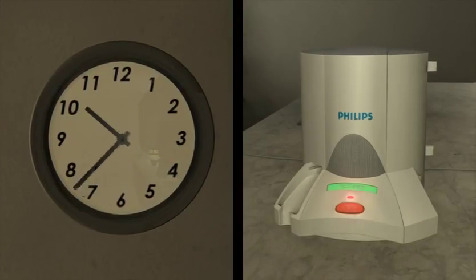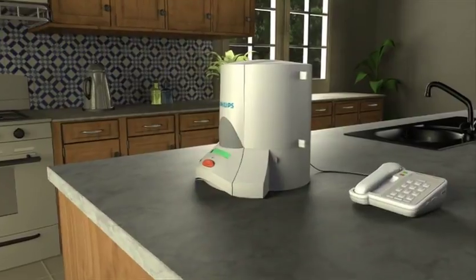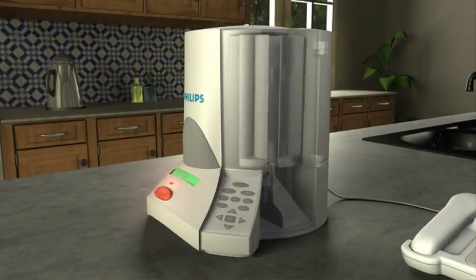If after 90 minutes the patient does not respond, the dose is automatically moved to a reserve bin inside the locked dispenser to prevent the risk of an accidental overdose, and the caregiver is notified.